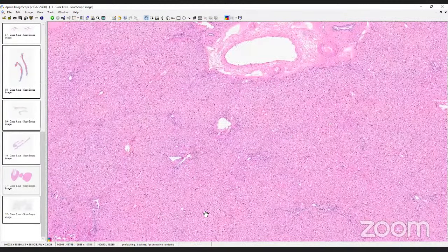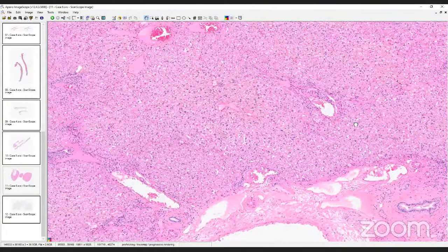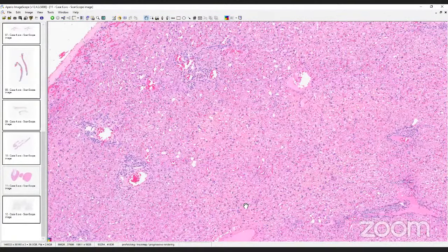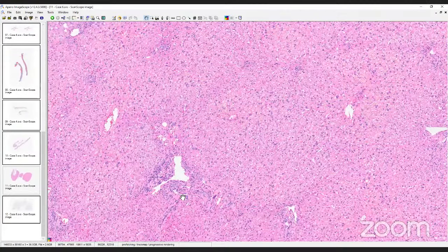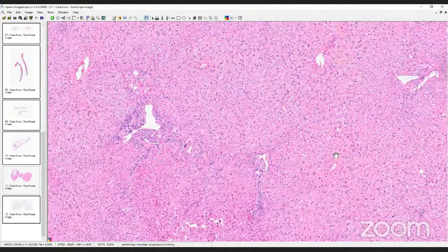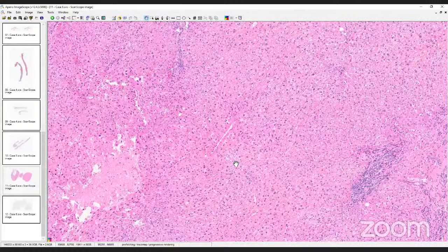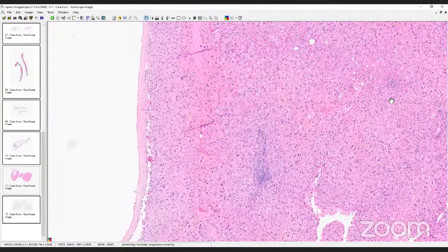And first of all, I just want to show the normal liver, or the uninvolved liver, because it's a beautiful sight to behold. There is some inflammation, and very minimal ductular reaction. I consider these to be non-specific findings in this particular case, because there is a mass-occupying lesion next door, but there is otherwise no steatosis or fibrosis or anything of that kind.